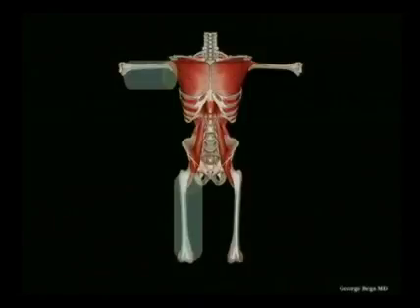Here, the idea is to replace fetal weight 2D variables with 3D volume-derived variables. So instead of using a femur length, you'd use a fetal thigh volume, and you replace this into the fetal weight formula. There are technical problems, especially in the distal parts of a bone. You can have shadowing. That's why one of the newer developments is to use the mid section of the thigh only, otherwise called the fractional thigh volume or the fractional arm volume.